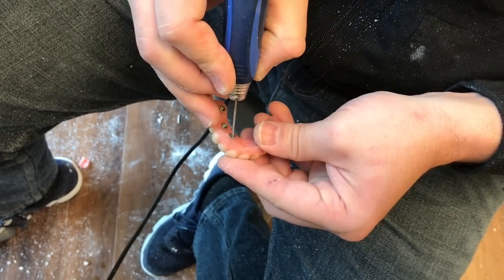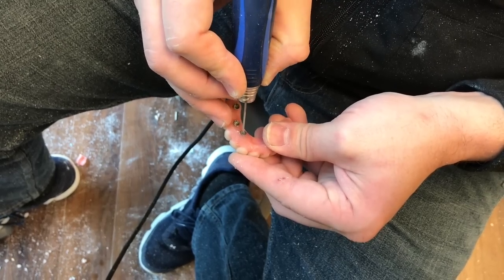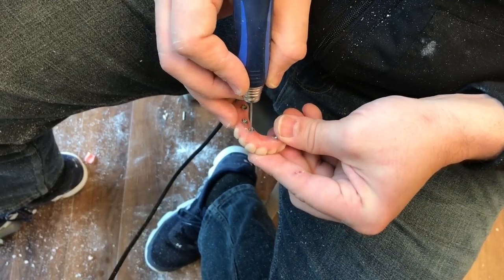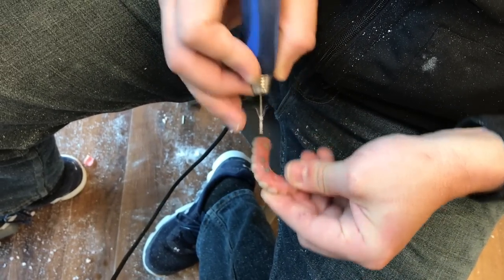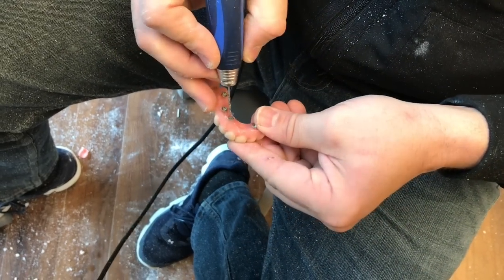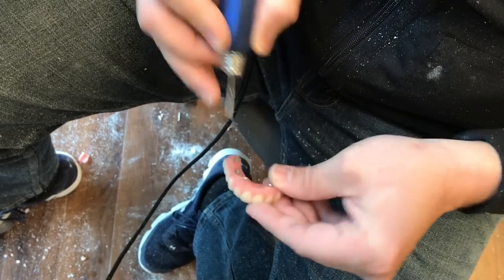Once that acrylic is set, we can create a pilot hole through the bottom of the tie base through to the occlusal surface of the prosthesis. We do this very methodically, just a little bit at a time, so that we don't create heat and pop the tie base out.